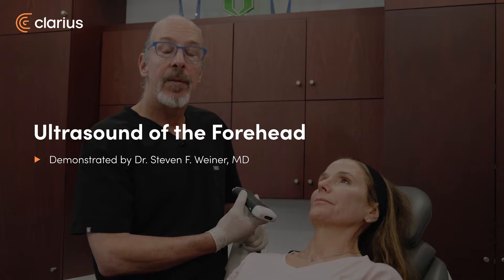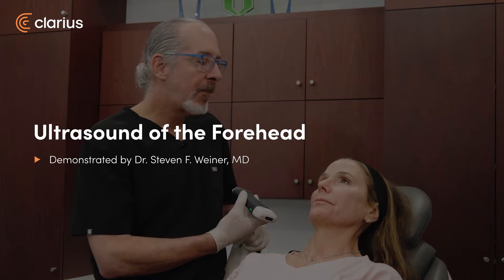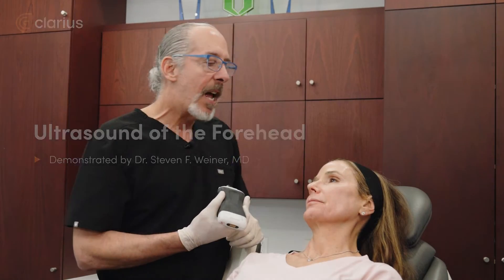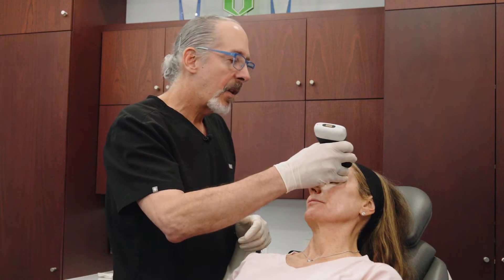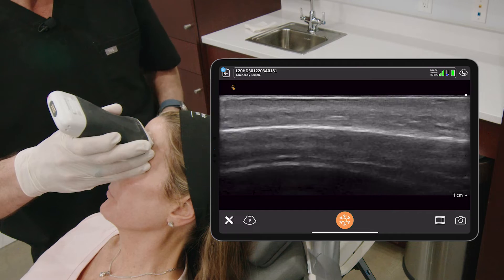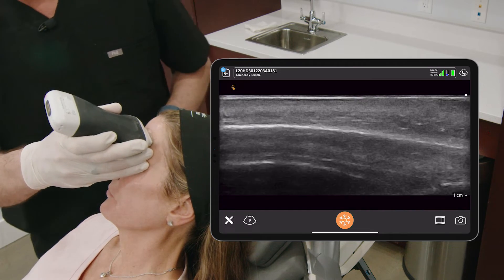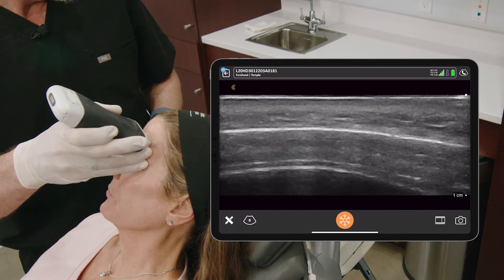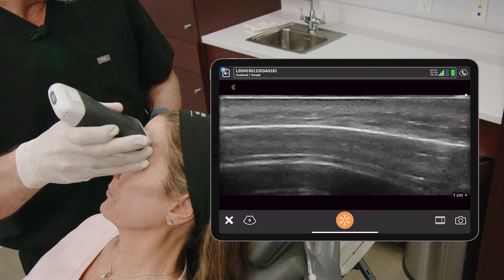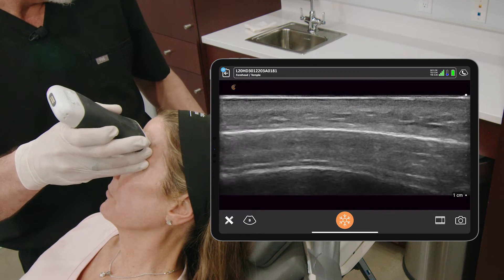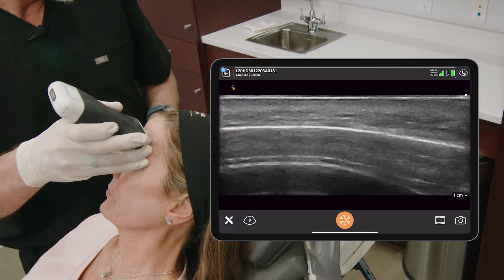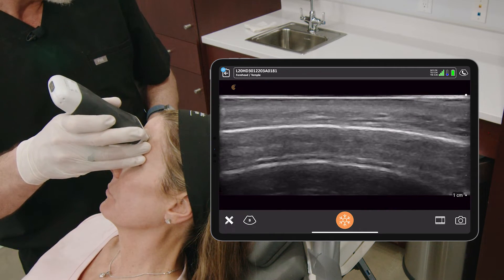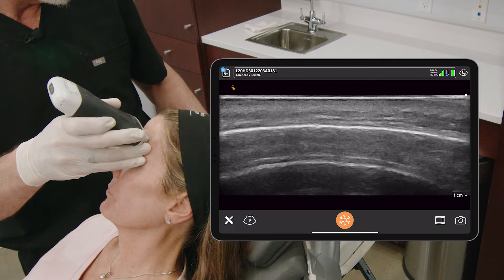The next area of evaluation is the forehead, and the forehead anatomy is not that complex. I'm using the preset for the forehead and temple and have the patient elevate the forehead. This patient has tox in it, so it's a little bit tough.